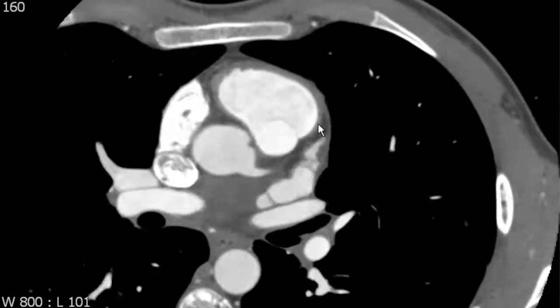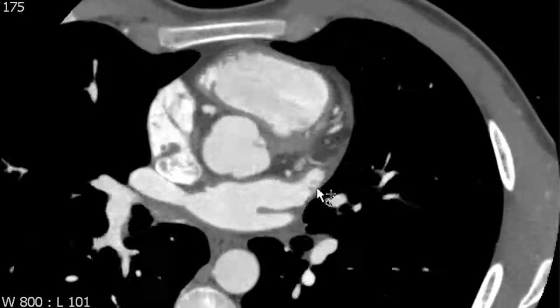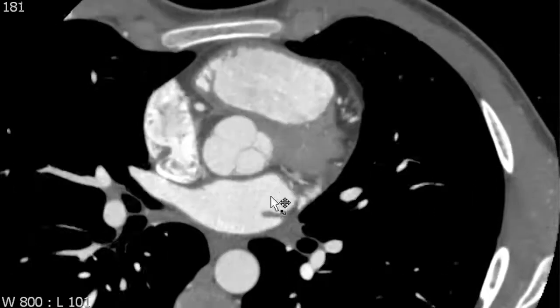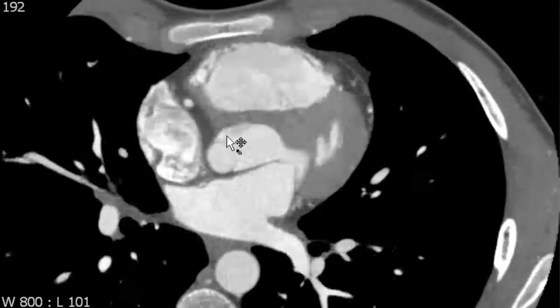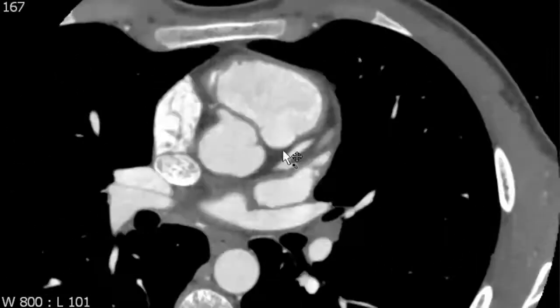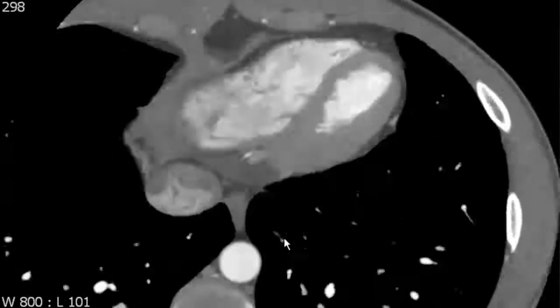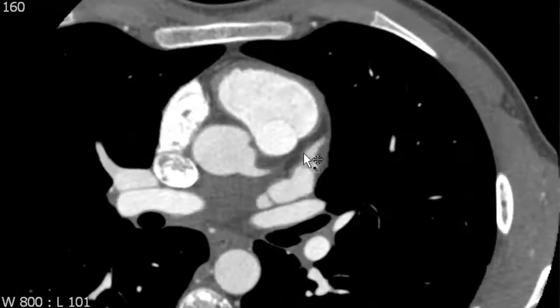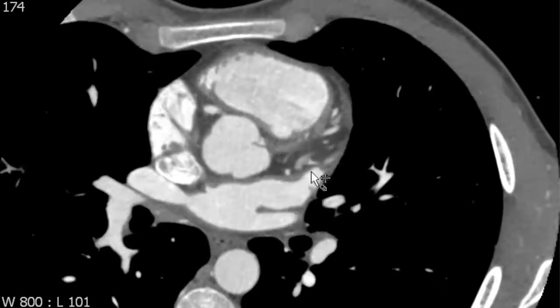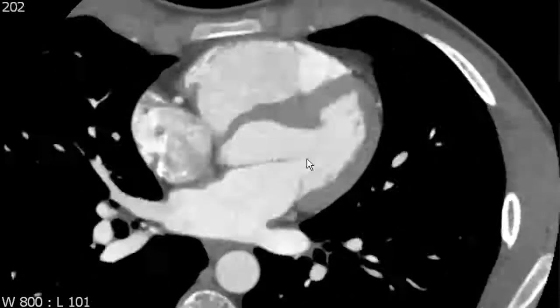The problem with thrombus formation in the left atrial appendage is that if that thrombus breaks free, it can travel straight into the systemic circulation and produce infarcts in the brain. On any type of scan you're reading, it's always useful to take a peek at the left atrial appendage to see if there's a thrombus in there, as that's an important observation to make.